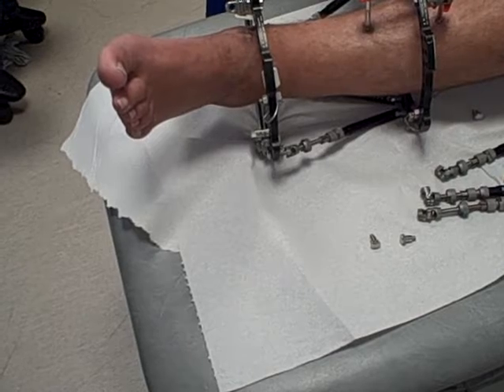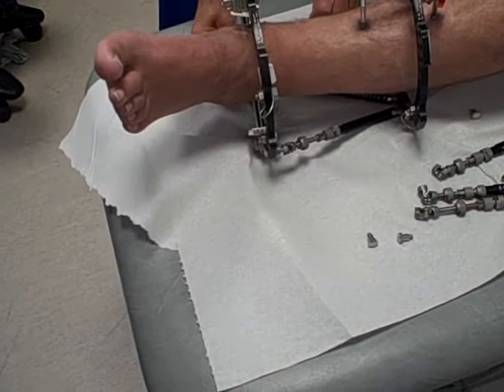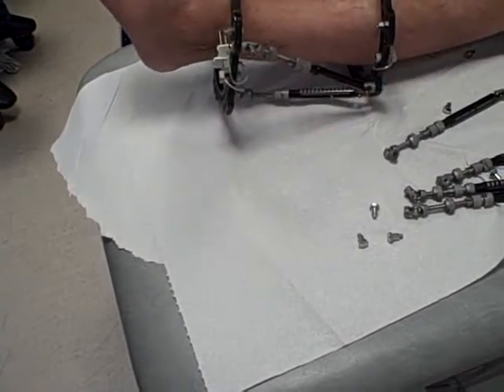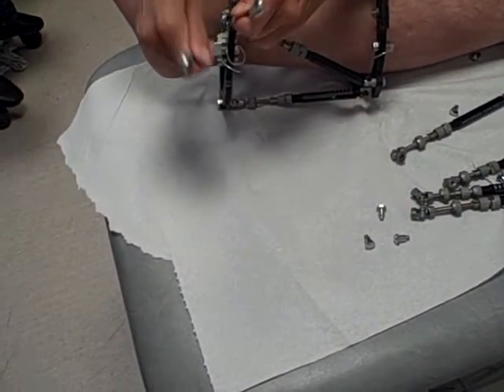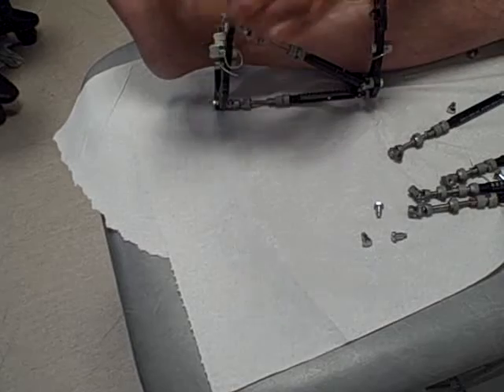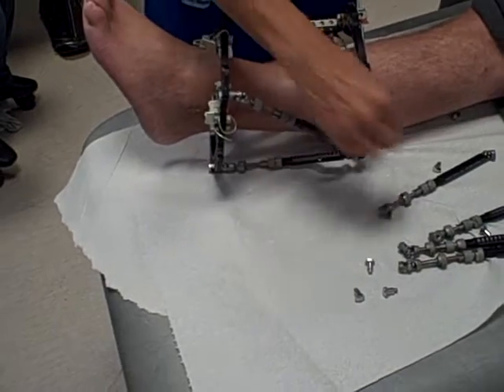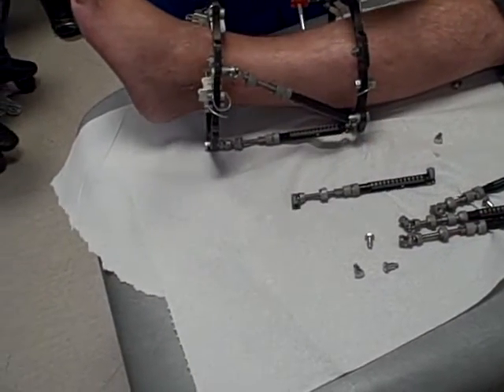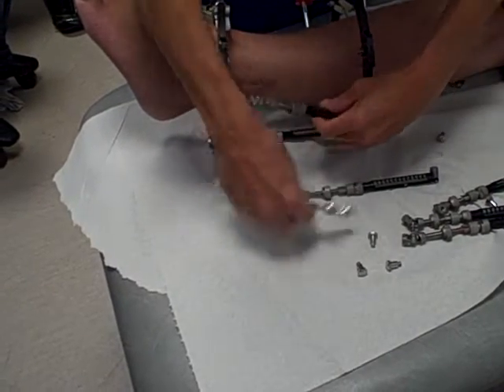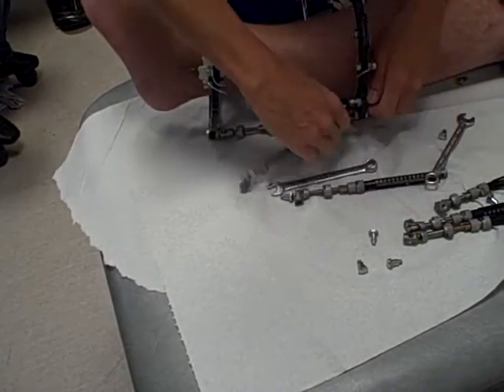In cases where we have a bit more doubt about whether the bone is healed, we might do a ten-minute walking test — if you go outside the hospital with your shoes on, walking around to see whether it starts to ache after a while. For some patients, we've even sent them home for a few days without the struts on to walk around. But in this case, we're pretty confident it's all going to be OK so we can take the struts off straight away. And if we are in doubt, what I do is put the numbers back on and make a note of which strut goes when, so that if we do need to put it back, we know which ones to use. But I don't think there's any doubt with yours — I think we're very well healed with this.